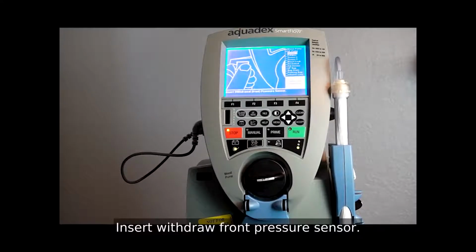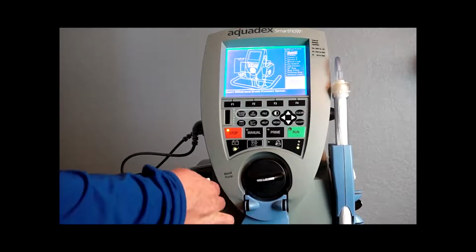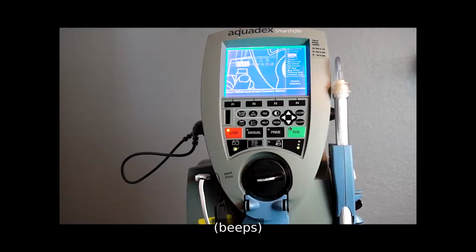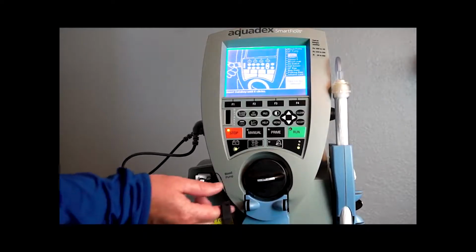Insert withdraw front pressure sensor. Insert data key until it clicks.